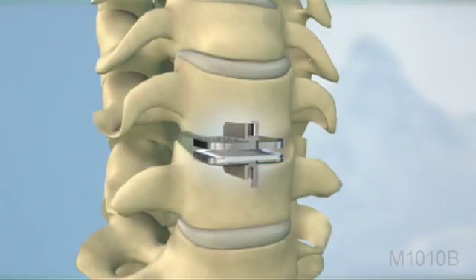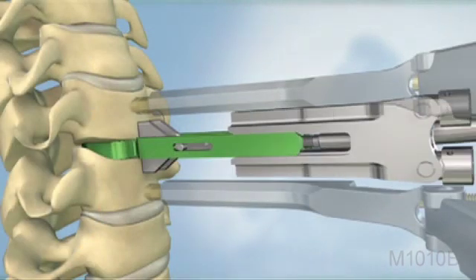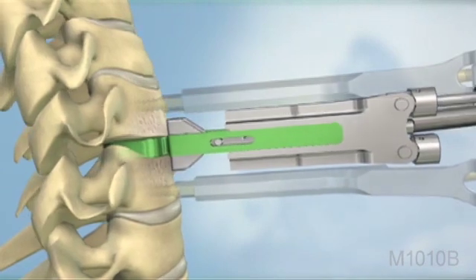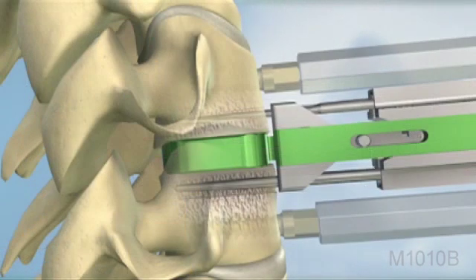Next, keel channels are prepared in the vertebral bodies above and below the disc space. The keel channels for the Prodisc C implant can be prepared using either a milling technique or a chiseling technique. In the milling technique, a milling bit is used to create the channels for the Prodisc C keel.